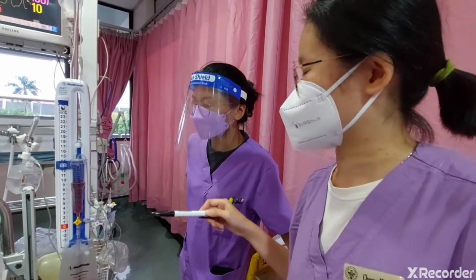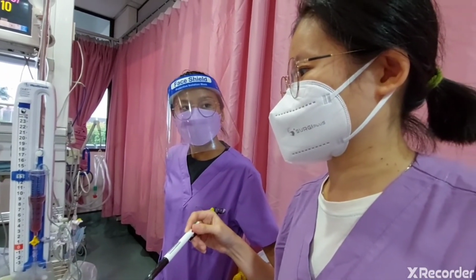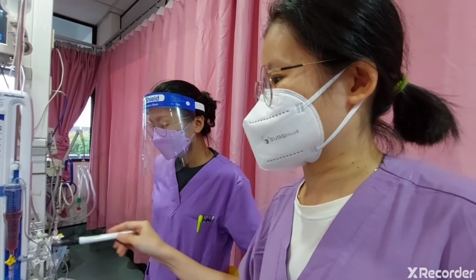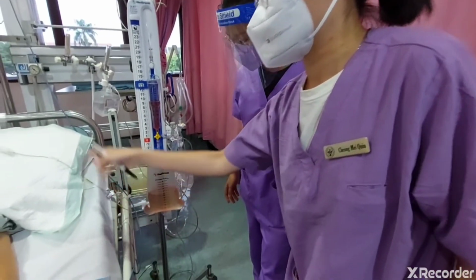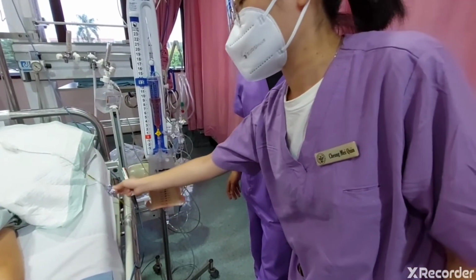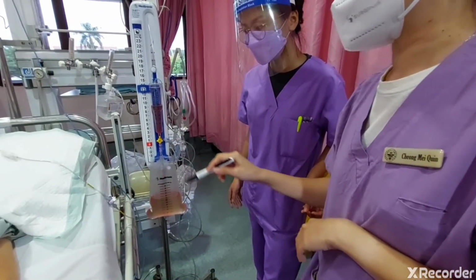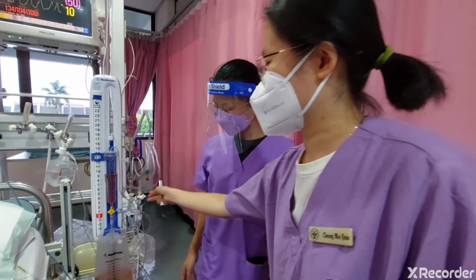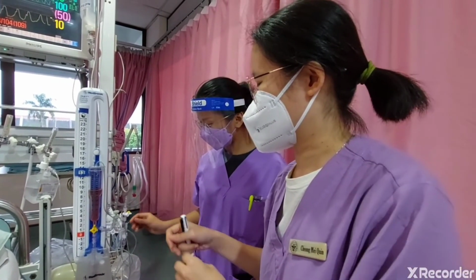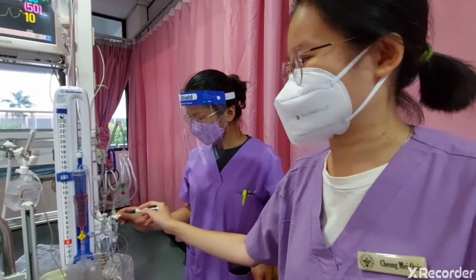Okay. Regarding the complication, if we drain out, every time we put up the patient, we must make sure we close the EVD. Excessive drainage can cause ventricular collapse. For this, every time we do zeroing, we need to hand wash and then swab with the alcohol swab to prevent any infection.